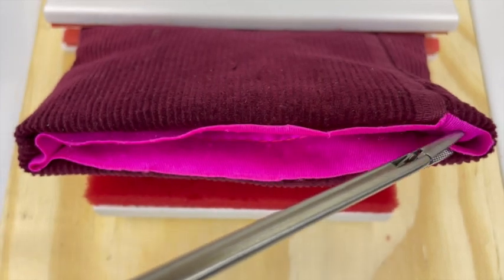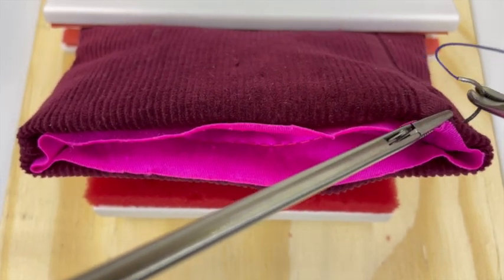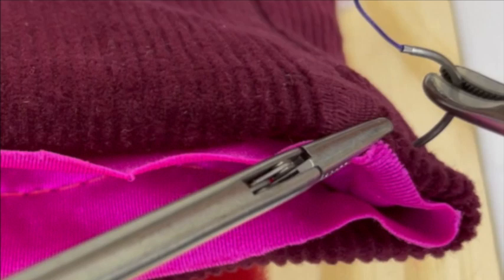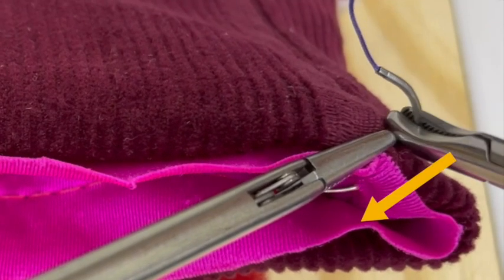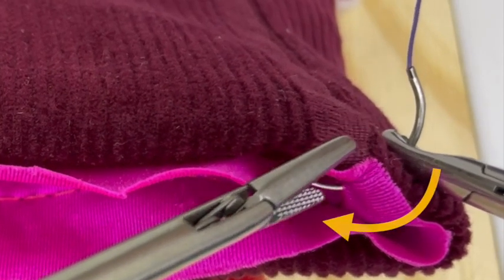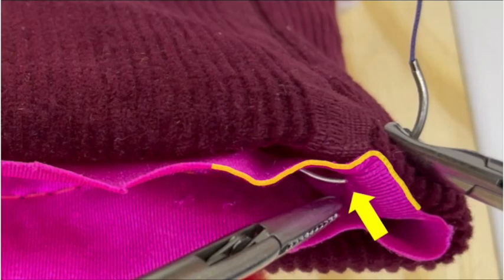Next, grasp the anterior vaginal epithelium at the right apex. Insert the needle at a 90 degree angle to the tissue. It is important to advance the needle straight through the tissue prior to rotating your hand. Once the needle tip is visualized, then proceed with rotating the needle. When the needle exits the vagina, it should incorporate the vaginal epithelium.